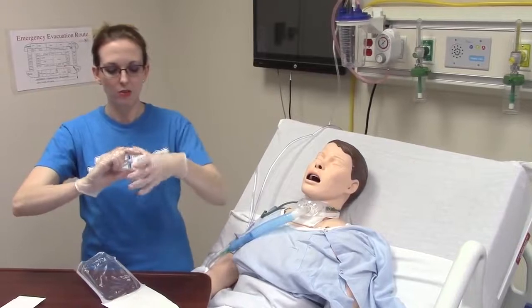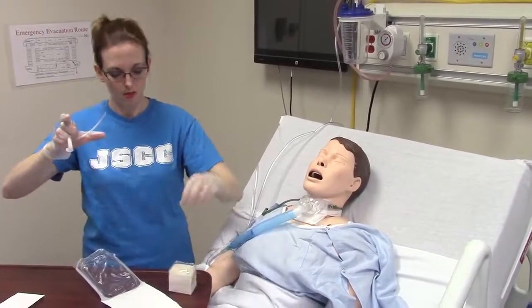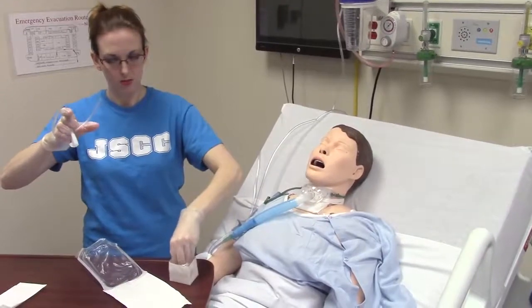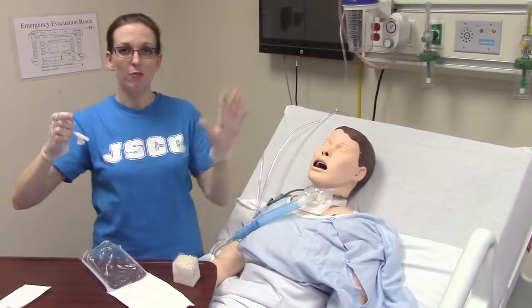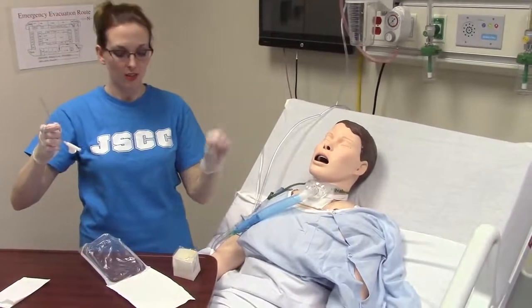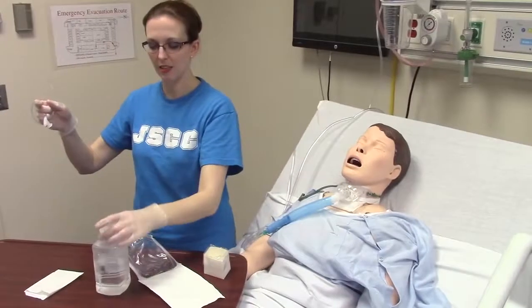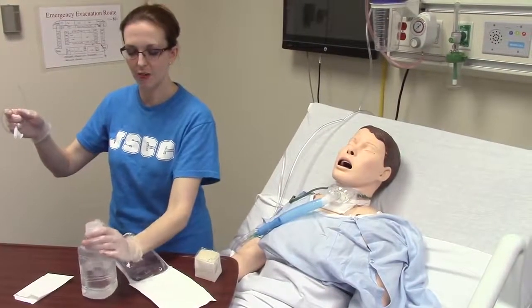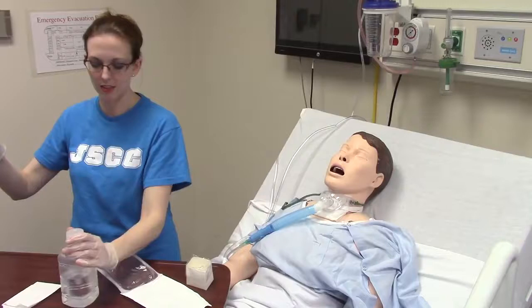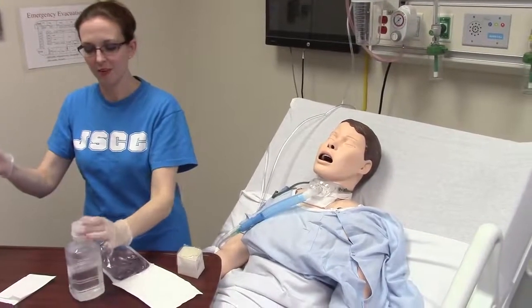This is your rinse — your saline rinse bucket. Now I'm ready to contaminate my non-dominant hand. I have my rinse bucket ready. I still have saline left over from trach care. If you haven't already performed trach care, you'll need to get a saline bucket ready.